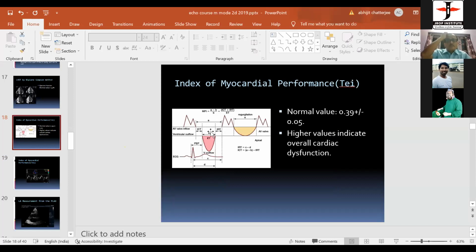Second question is like measuring aortic valve area by planimetry. He says we underestimate aortic valve area by planimetry. Now, doctor, I'll answer your question. Whenever in adult cardiology, you want to measure the aortic valve area, never try to do planimetry. You'll go haywire. You'll be absolutely wrong. The measurement should always be taken by Doppler, continuity equation, and peak and mean gradient. Am I clear to you? Yes, sir. We will teach you, when we teach aortic valve stenosis, we'll tell you how to do that.